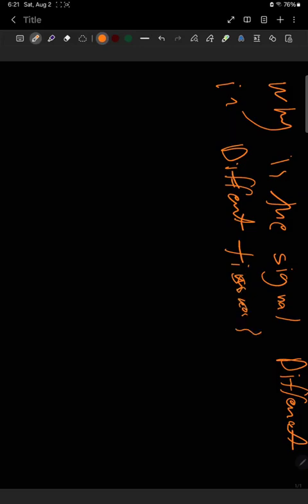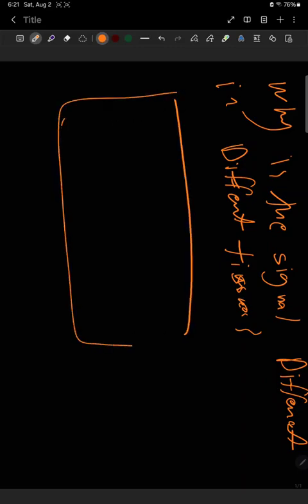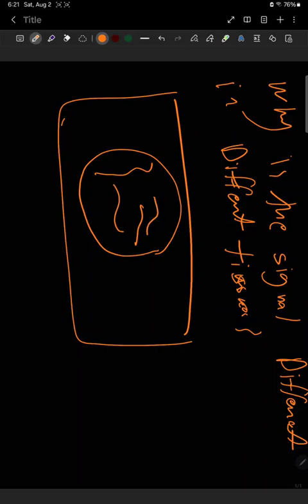So they mean, if we have, this is the image in general, this is the brain, for example. Why would some parts look different from each other? So this will be more gray, this would be more dark, this would be more light, etc. Okay, that of course gives diagnostic information.